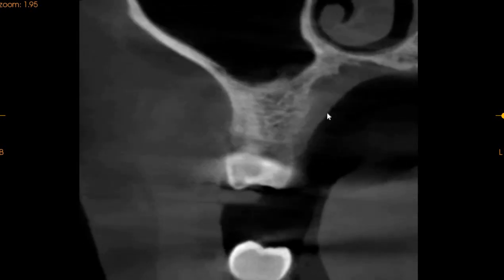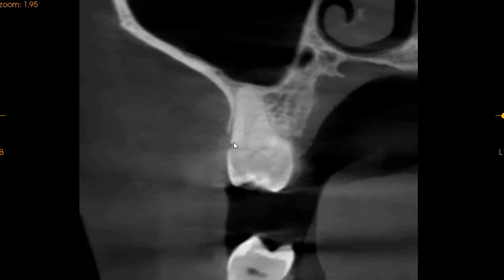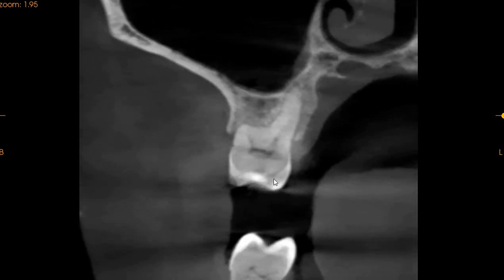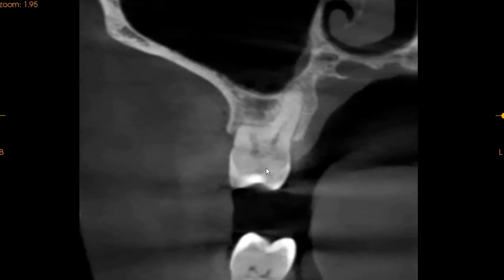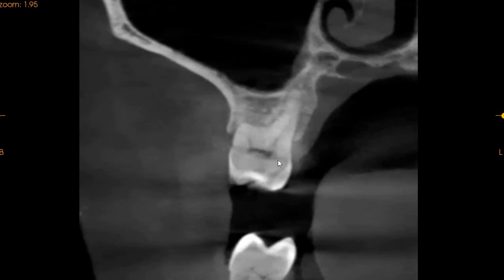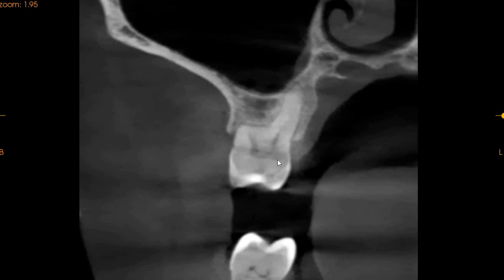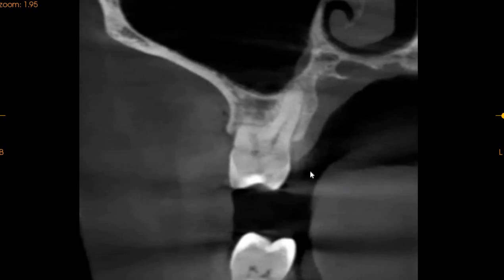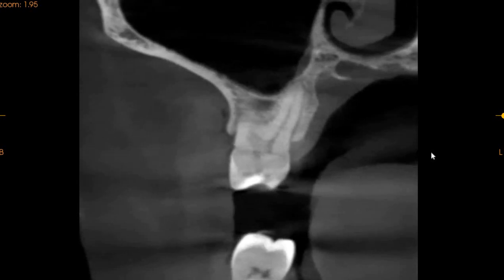Moving to the 6th region — in the 6th region we've got a Class 5 lesion. And then moving on, we've got a Class 1 lesion which is extending right close to the pulp here. This could also be the cause of her pain or sensitivity in the 6th region. So this is what we see on this patient's upper left quadrant.